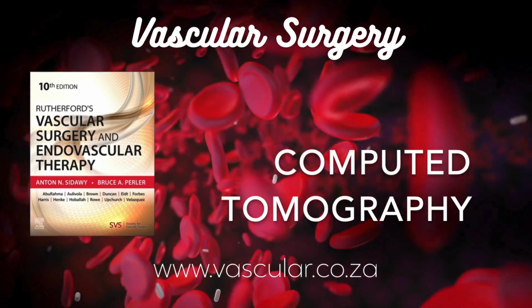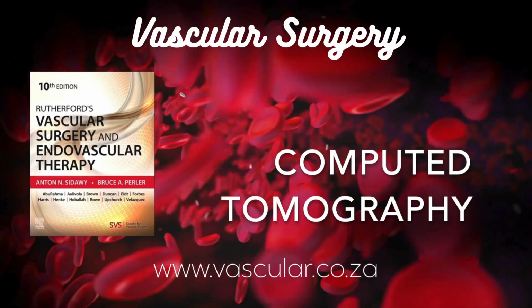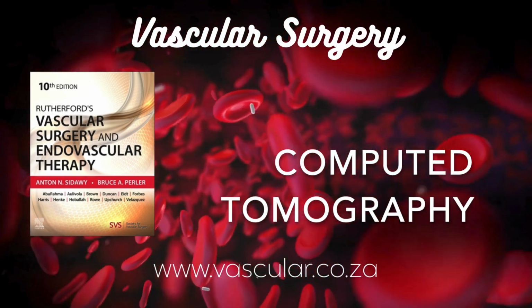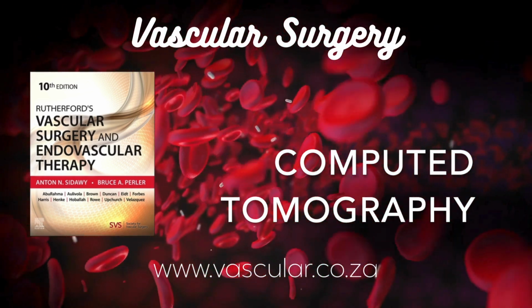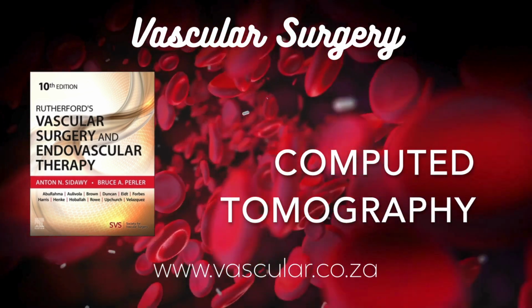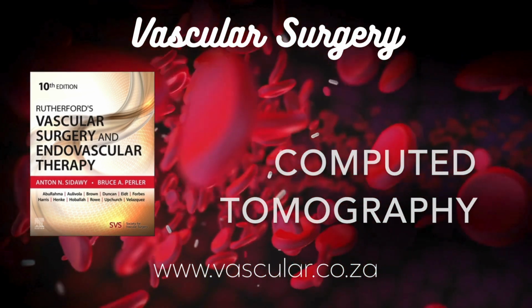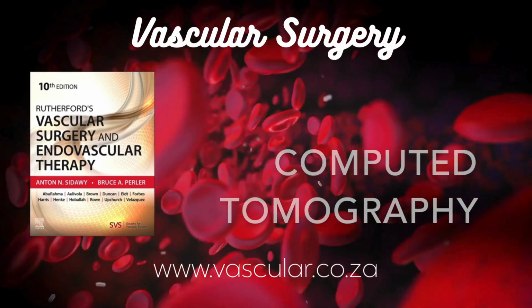Okay, so CT is amazing, but not perfect. We touched on contrast risks. What about the radiation? That seems to be a growing concern. It absolutely is. Public and medical awareness of radiation dose from CT has increased significantly, especially as CT use has just exploded over the last couple of decades.